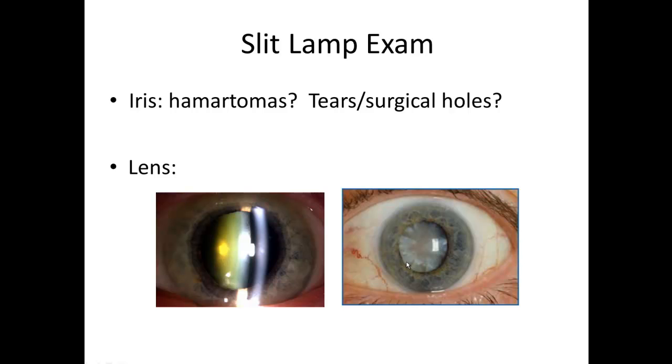Over here you see a pretty mature cataract — it's almost opaque white. The chances that a person would be able to see through a lens that thick is pretty slim to none. Luckily, cataract surgery can clear that right up and give them almost perfect vision again.